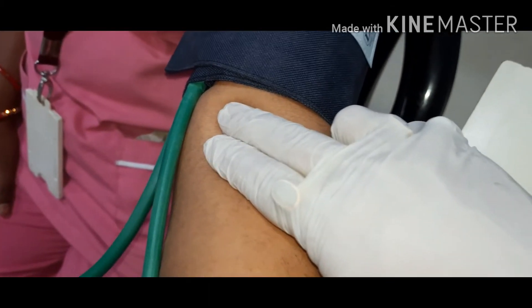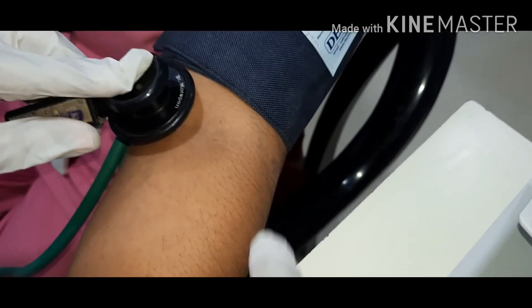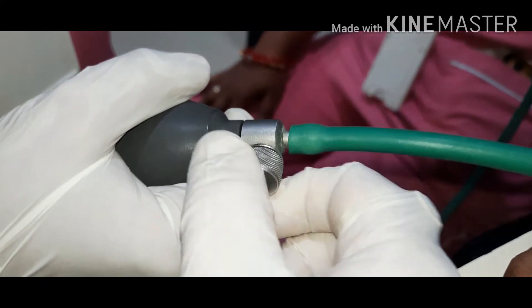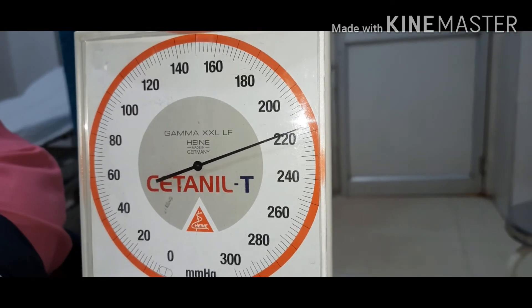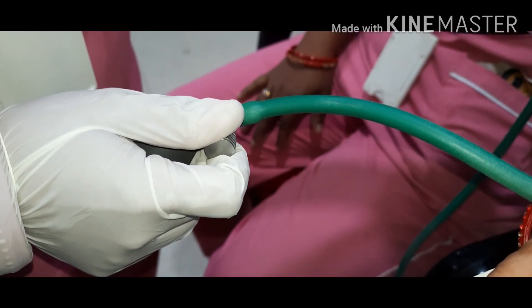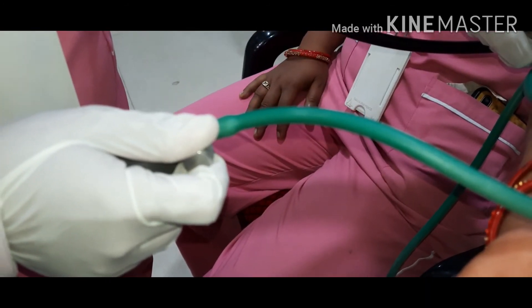Then you place the stethoscope on that position, tie the valve, and keep the pressure to the BP cuff. Take it to the maximum and then slowly release the BP cuff to achieve the blood pressure reading.